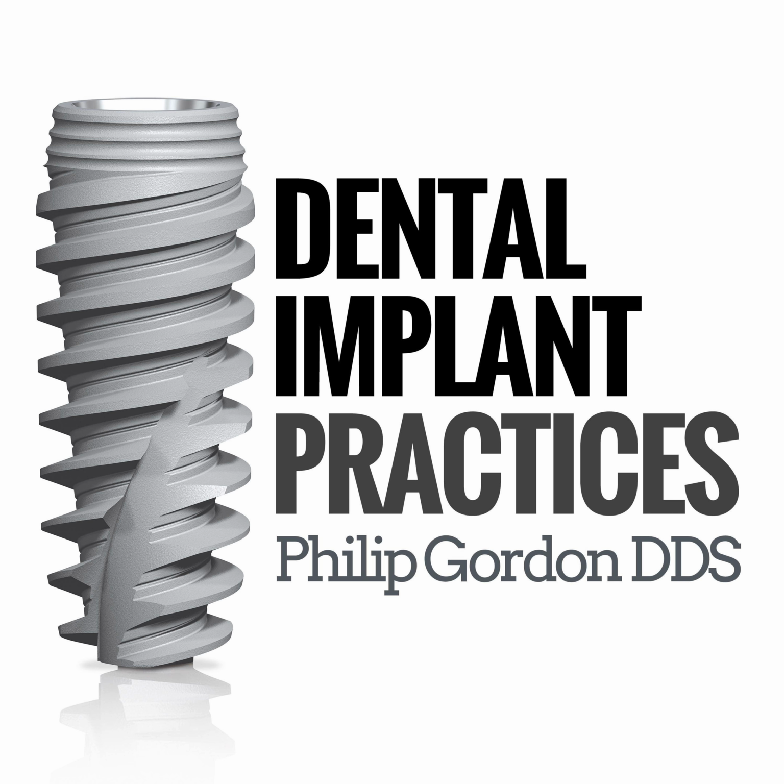For all of the implants that I listed, there is a micro thread zone near the collar, which is supposed to be placed at the bone or slightly below the bone. Then there are the buttress threads in the body of the implant. Then there are the self-tapping groove threads at the apex. So there are some different changes in implant lengths and diameters, but there's also changes in the shape of the implant as it goes down.